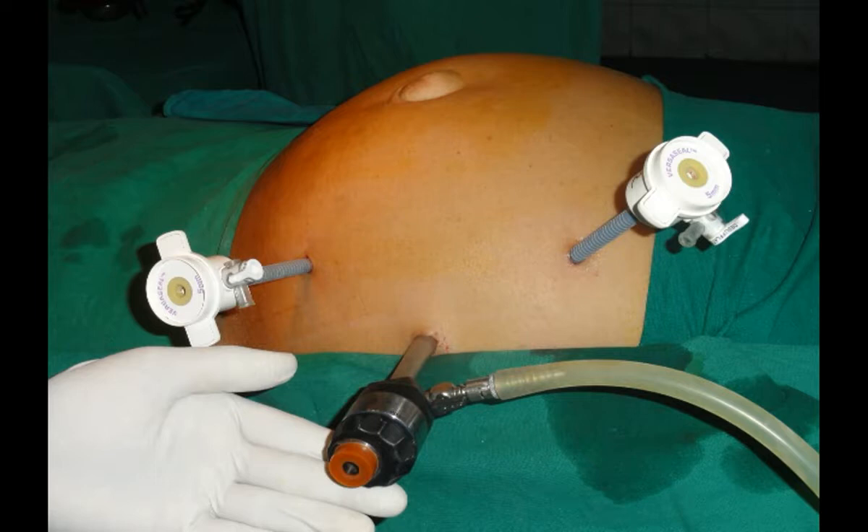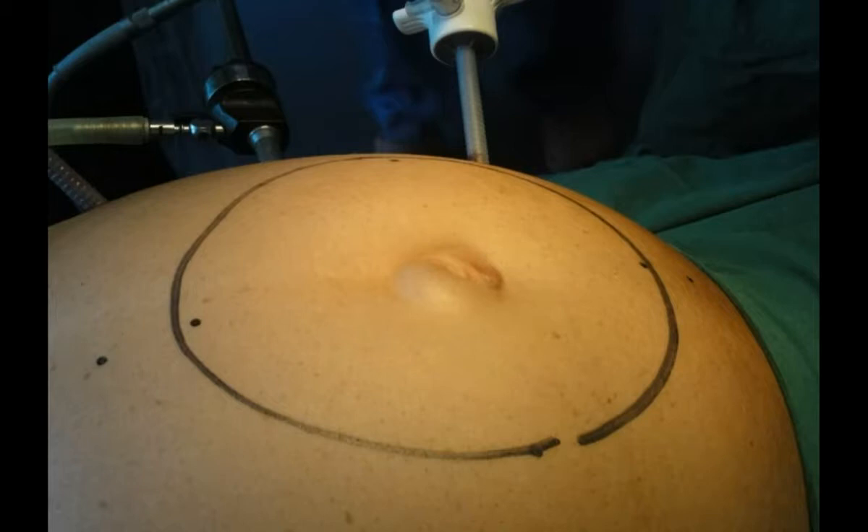This umbilical hernia is about two and a half centimeters in diameter with a small omentum tucked in there, presenting with pain. Only three ports are used here: two 5mm ports, one inserted at Palmer's point, the other in the left iliac fossa, and a 10mm port for the 30-degree camera, through which the mesh is also introduced.